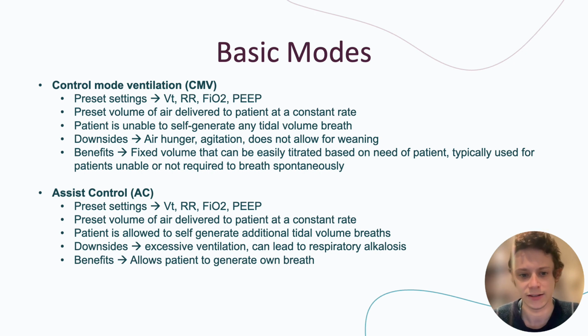The preset settings, so once again, this is why those parameters are important. The preset settings in CMV are tidal volume, respiration rate, FiO2, and PEEP. This is a volume-controlled setting, which means there is a set volume delivered to the patient every certain number of seconds, depending on the respiration rate. The patient in CMV is not able to generate their own tidal volume breaths. So the only oxygen being delivered to the patient is that set rate of volume of air.